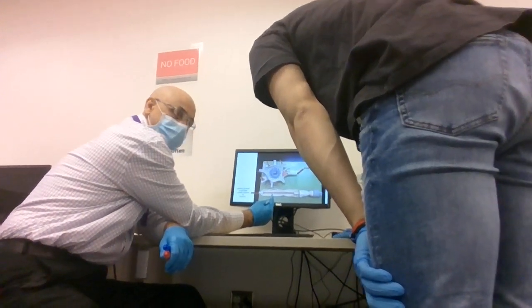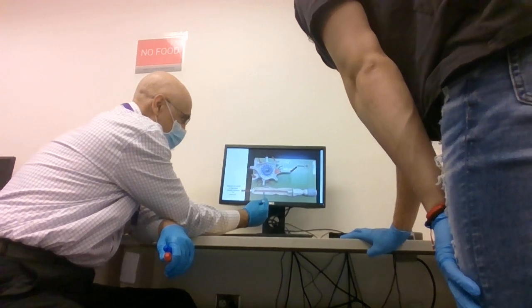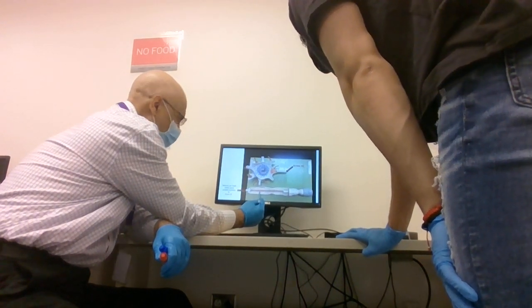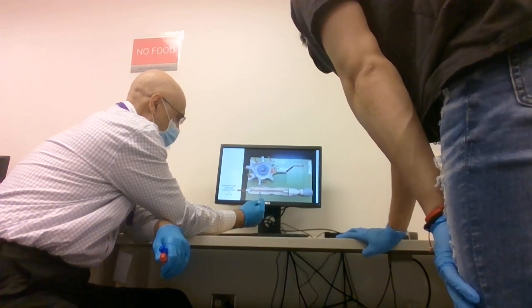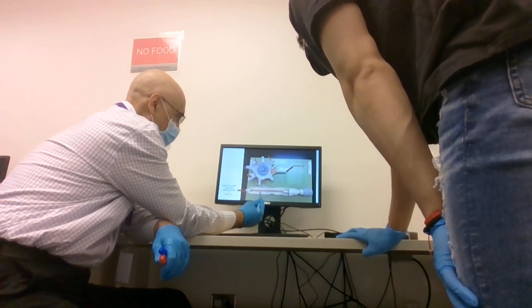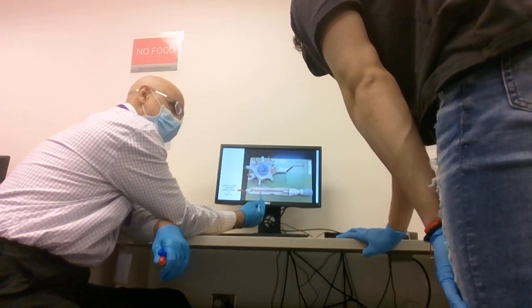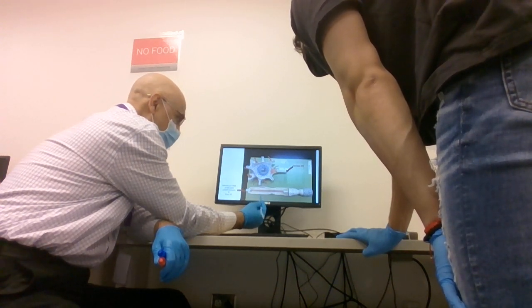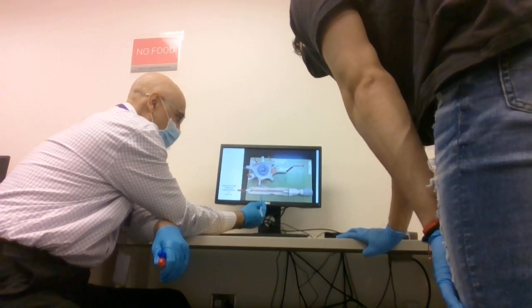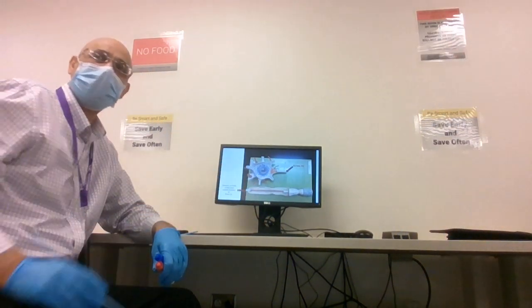Okay, guys, listen to me. In the middle, it is the Schwann cell. This middle is the myelin sheath, isn't it? The structure is the myelin sheath. But if it asks what is this cell, you say it's a Schwann cell. If it asks what is this structure, you say it's the myelin sheath. But if you point to this outermost layer, at the edge, that's the neurolemma. That's the key thing.